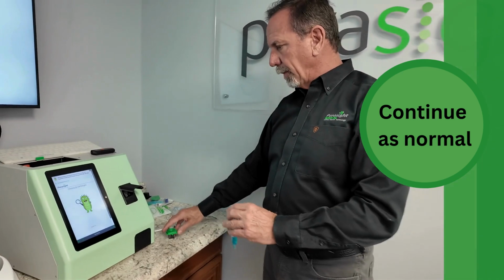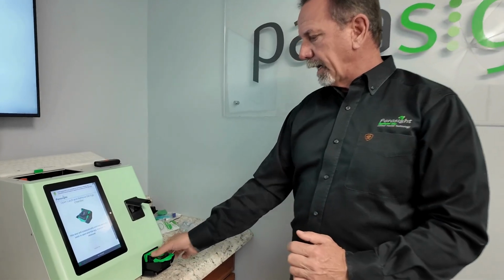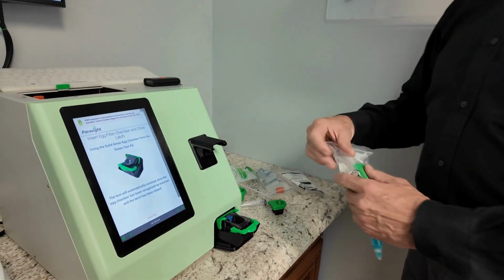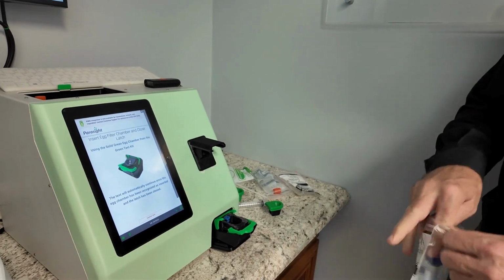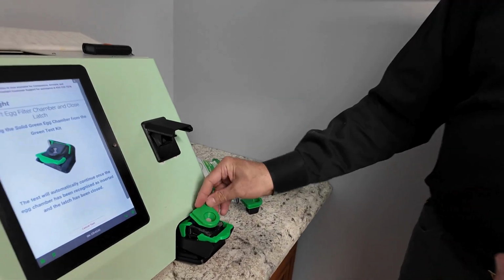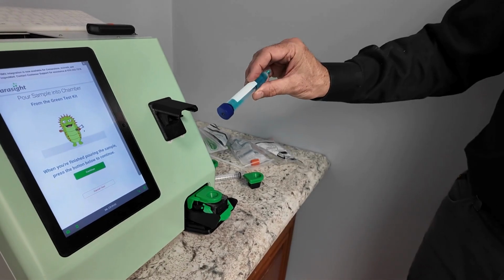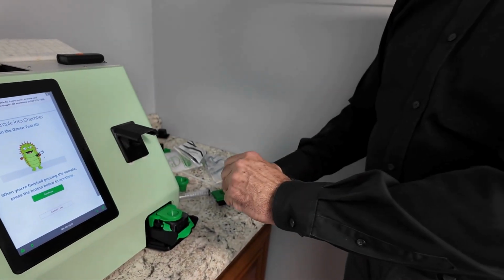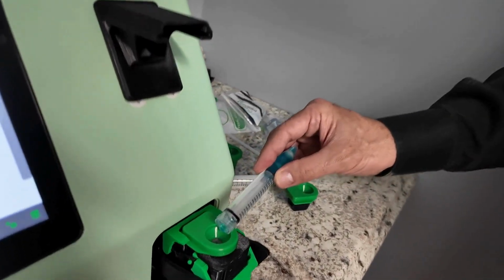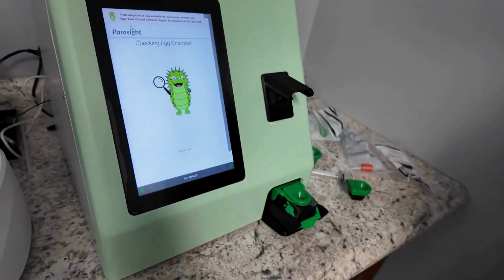And just as you normally would, it will confirm that you're running the right test. You'll take out the egg chamber that's there. You'll go ahead and put in a new egg chamber or specimen chamber. You'll be able to go ahead and set that up. And then remember, because we have this set up this way, when it starts vacuuming and you can hear it, you can go ahead and pour that in there, and you'll see it does not clog at that point. It'll go ahead and come through. Then you hit continue when you're done.